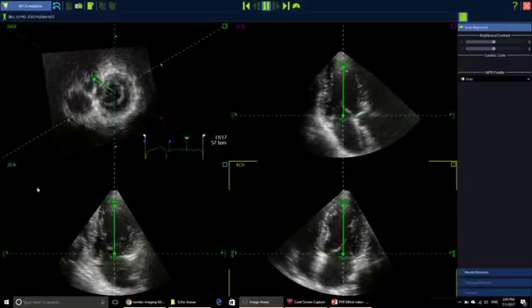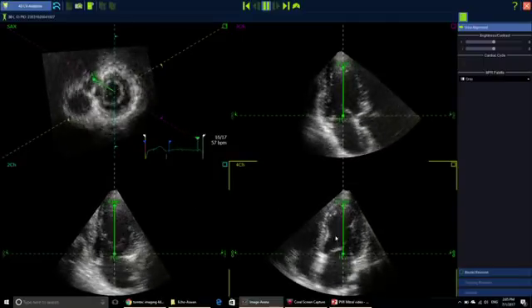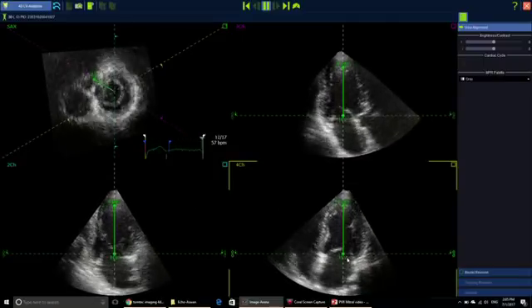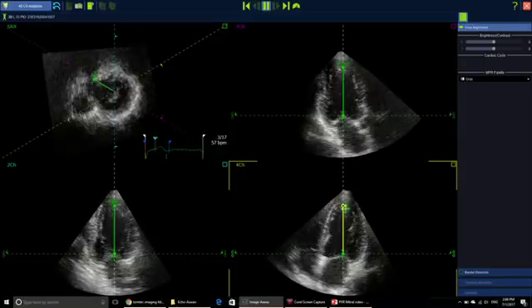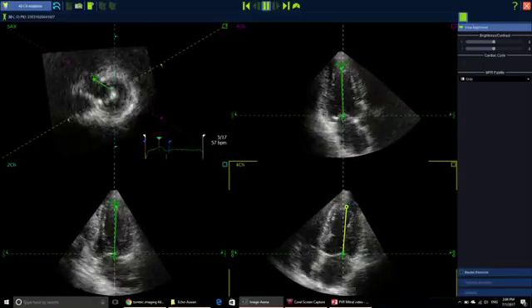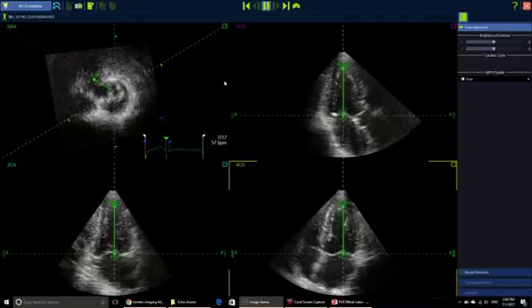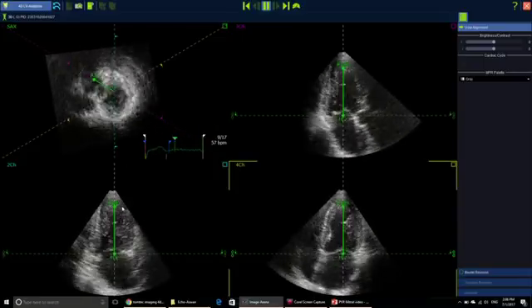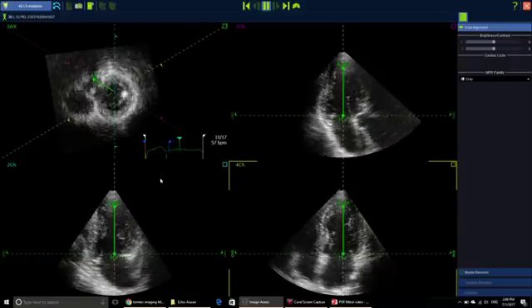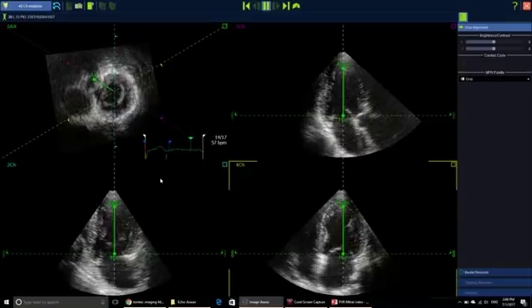Here is also the two-chamber view — mitral valve is down, apex is up. And here is a four-chamber view — mitral valve is down and apex is up. You don't need to edit anything if everything is okay, but you have the luxury to edit if you want. If you need to point the apex to a different side, that is okay. You can also change the point of the aortic valve if needed. Leaving things as-is greatly helps the reproducibility of the results.